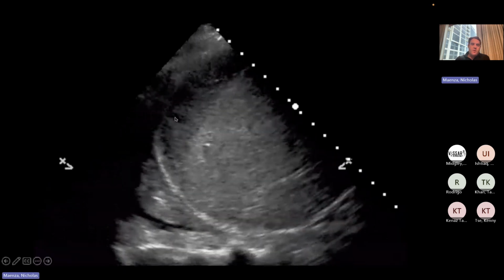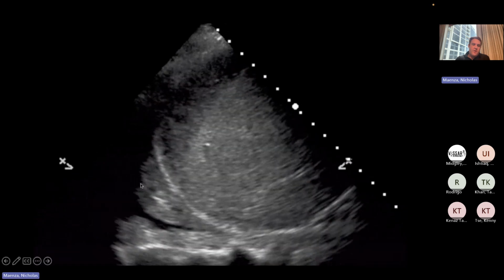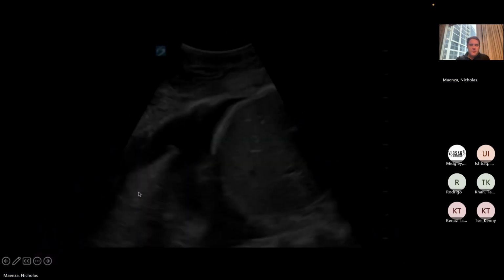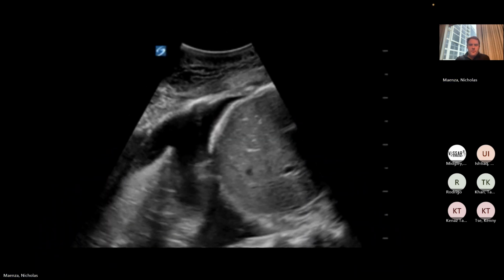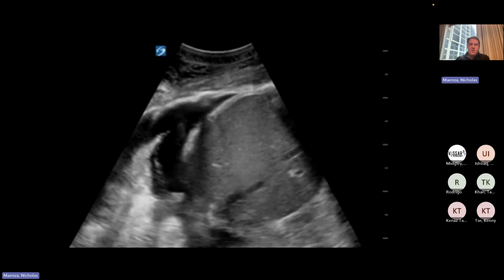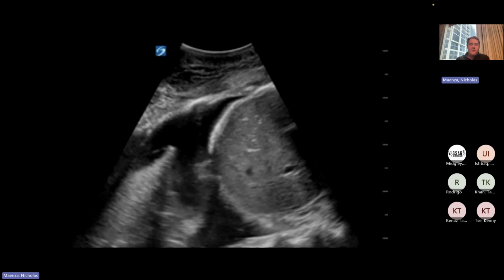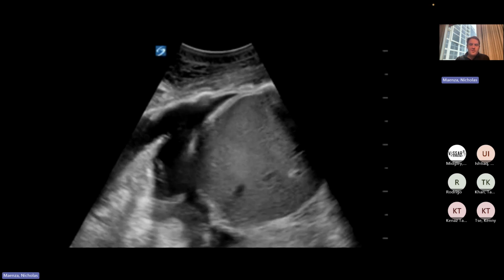Or this is another view of it where you're getting diaphragm and liver down here, and then you're getting this little bit of lung that's been compressed with all this pulmonary edema right here and pleural effusion. And then just another picture because it's so satisfying to watch the lung flop back and forth in the pleural effusion.